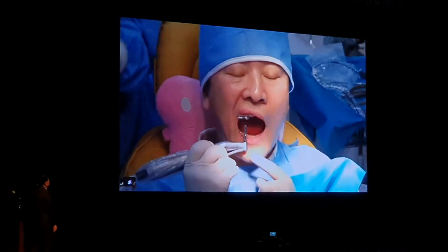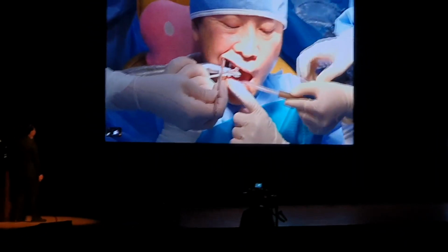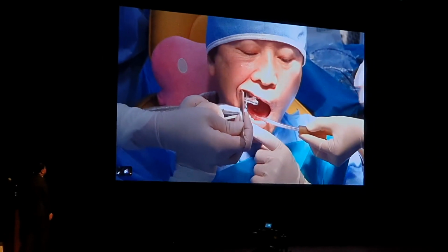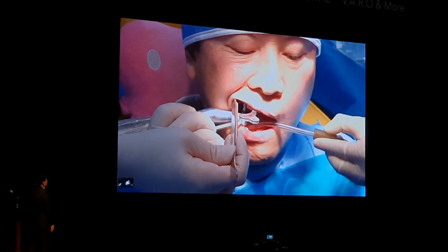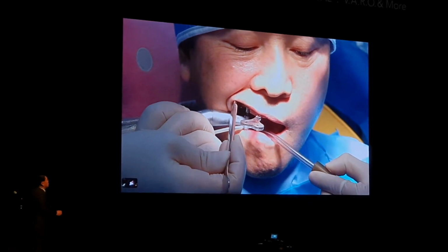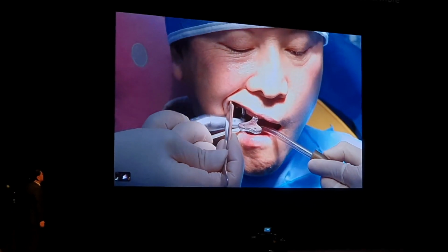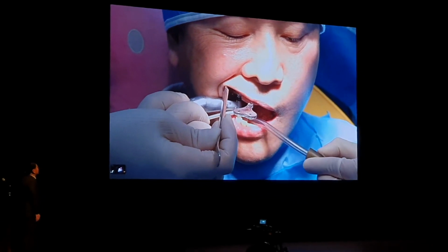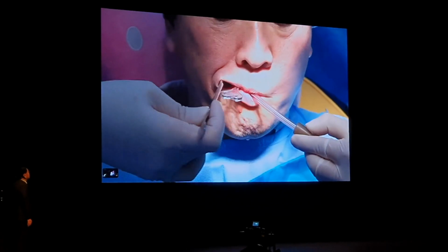So the final drill. Up to now we achieved the 4.5 to 8.5 site and need the final drill. We'll drill up to our full length, 10 millimeter. The plan is placing 5 millimeter diameter and 10 millimeter length implants, planned by the patient, of course. So can you open for 5 millimeter and 10 millimeter implants?